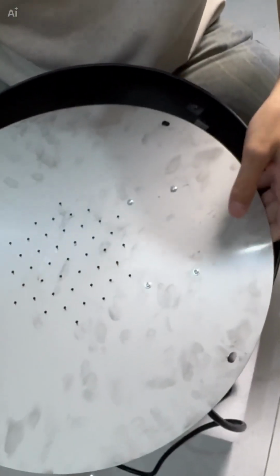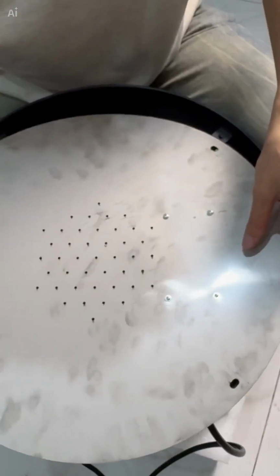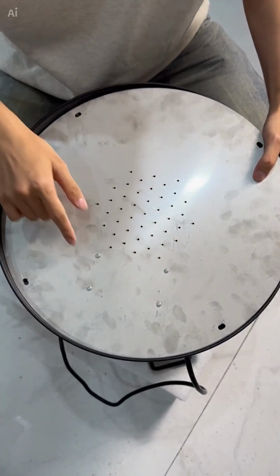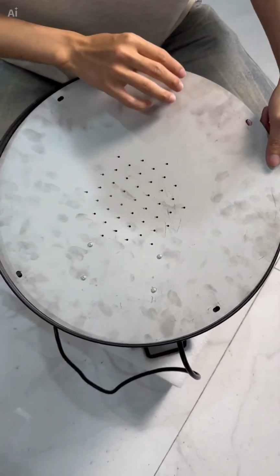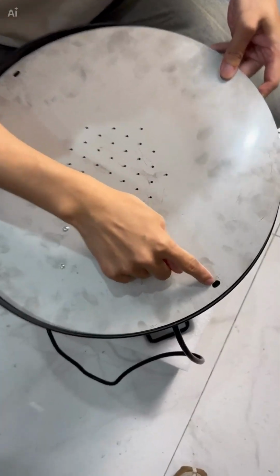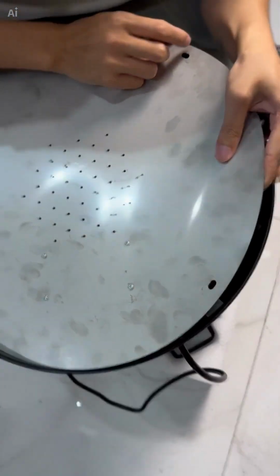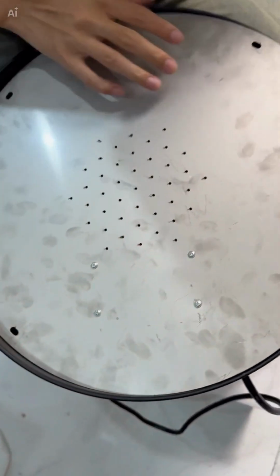Okay, now we have completed the assembly of the plastic base shell and the bottom plate. We have just finished installing the black plastic shell, and now we will start installing the bottom plate. Now, when we install the base plate, we need to align the 4 holes of the base plate with the 4 holes underneath. We can rotate it.